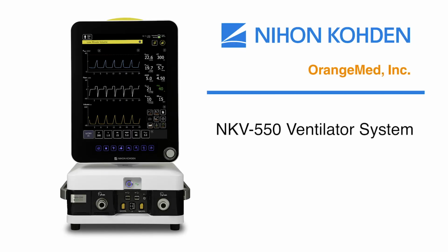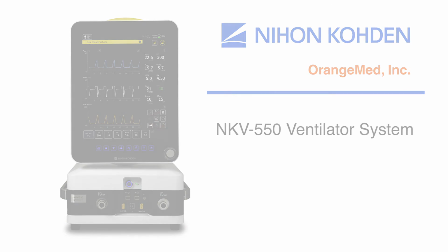This concludes the NKV 550 system overview.